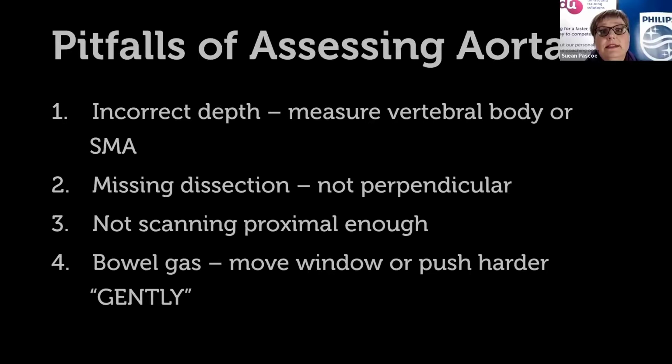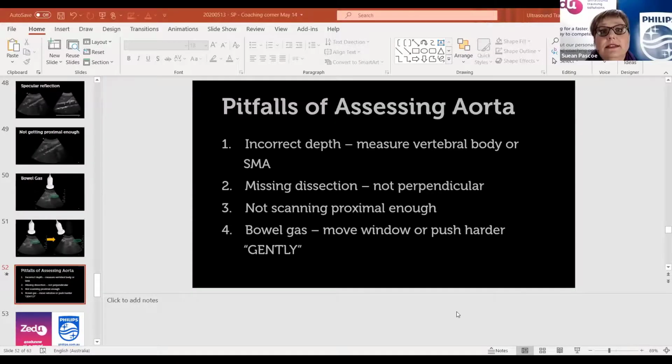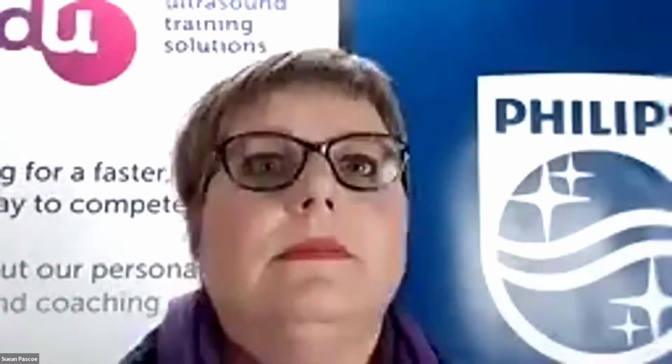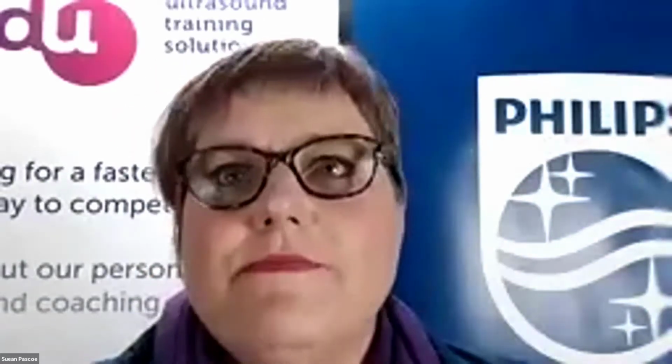The aorta. Does anyone have any other suggestions? Daniela, is there anything else you do when you're going after an aorta, a stubborn aorta?